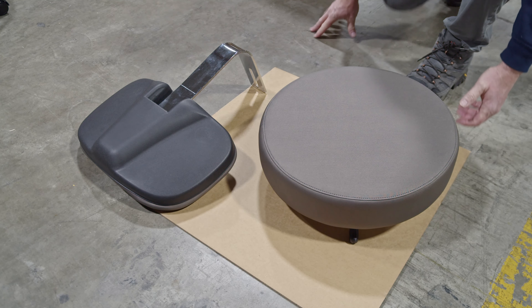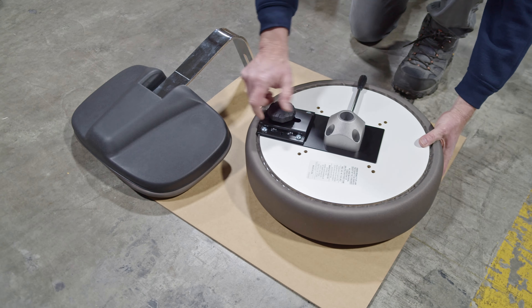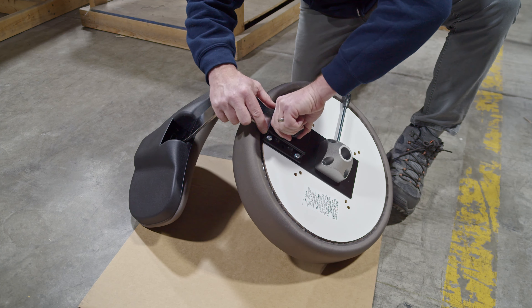In order to attach the seat back to the stool, flip the seat over to the side and find the knob for the seat back. Unscrew the knob, then attach the back, and tightly screw the knob back on.